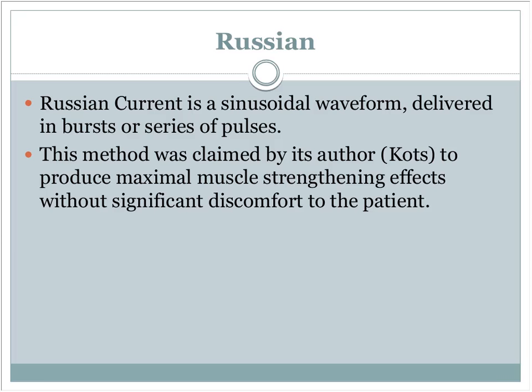The reason for that is artificial stimulation of a muscle will only work to a certain point. After that, it's the body's normal function that will make the muscle contract more effectively, efficiently, and develop more strength.